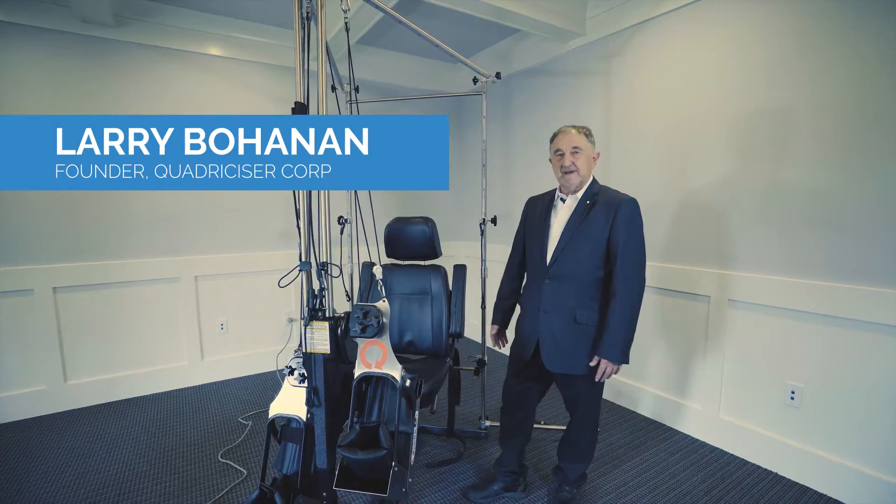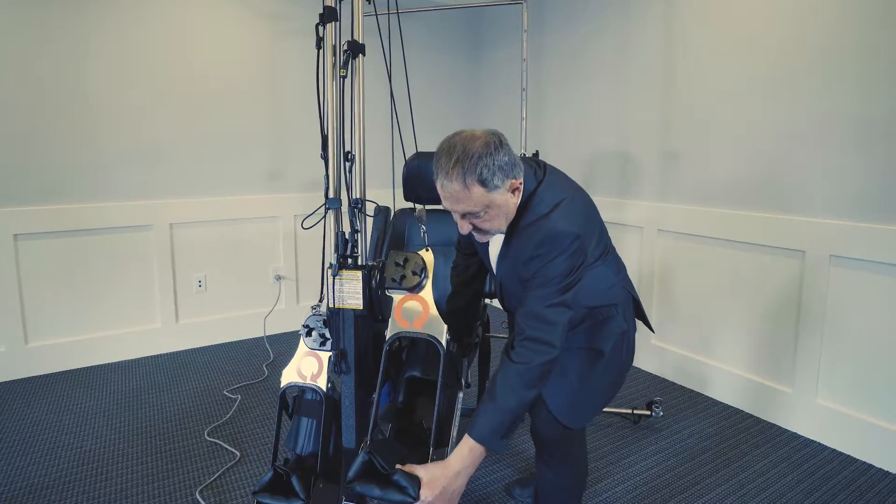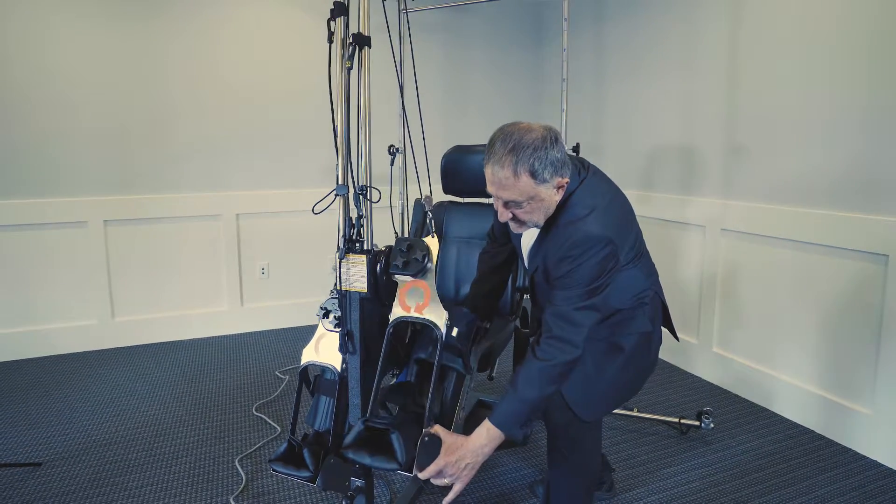What the Quadriciser is developed for is to give range of motion and neuromuscular reeducation. This pumping of the ankles helps with the dorsiflexion and plantarflexion.